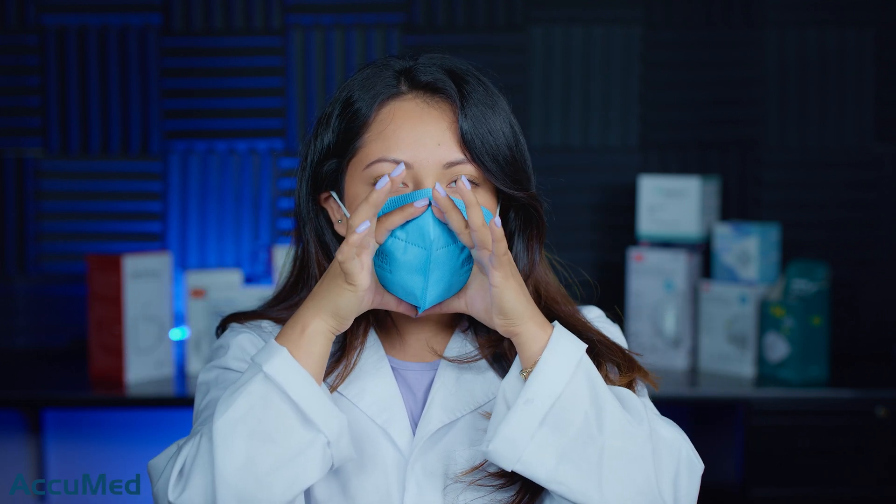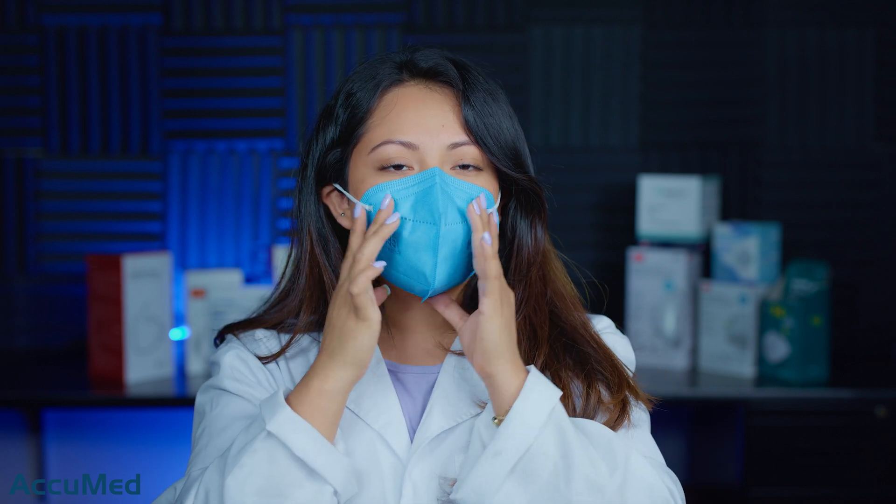The ear loops are actually pretty loose and I'm not getting a good seal. I'm going to try to seal this here. And as you guys can see, it has quite a bit of collapse.